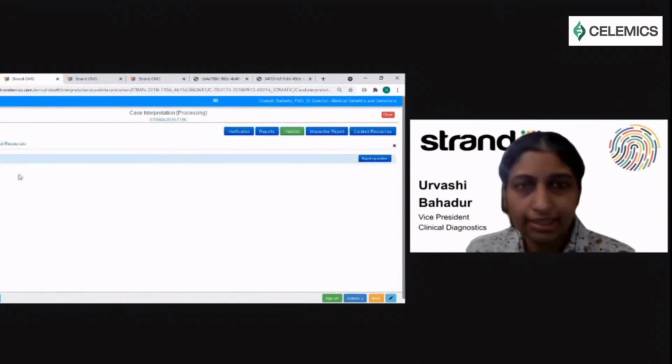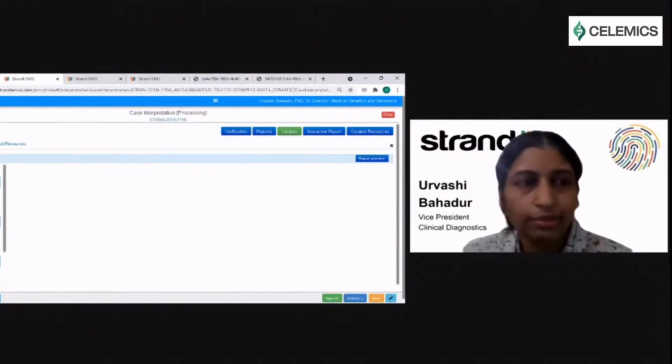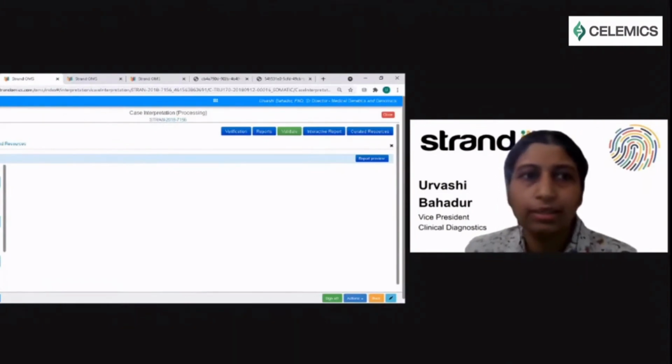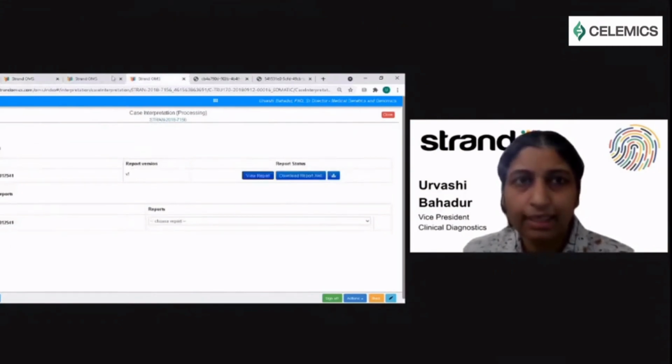So in this case, the variants that we have, we've chosen 4. There's CDK4, KRAS, MYC, and PIK3CA. So let's see that once we know these are the gain of function variants, what we will do is now look at the therapy implications for each one of them. So now that we know that we're supposed to look at the therapy, let's look at what that looks like.